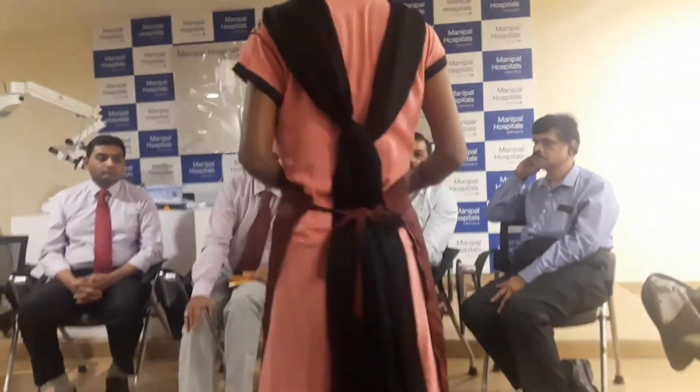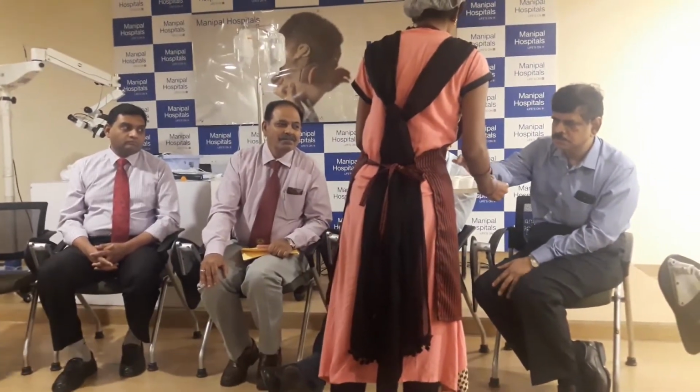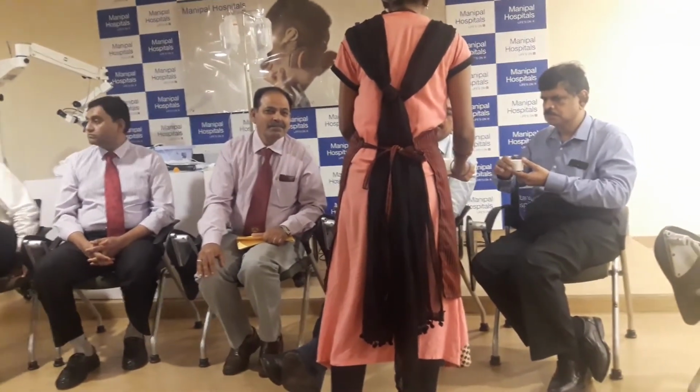At the 3rd month, you check up, and then you see whether a hearing aid trial should be given. If the hearing aid will not help, then these are the people who will need further attention. If after 3 months they have not recovered, the chances of recovery are very much lower than before. 3 months is the reason.